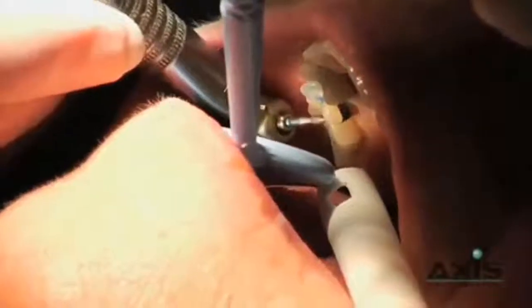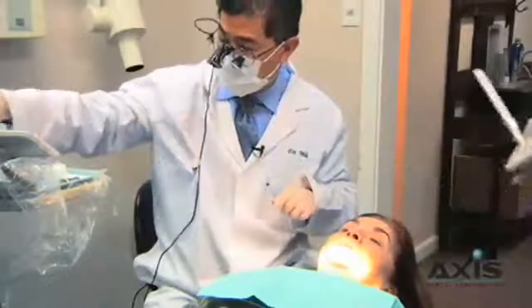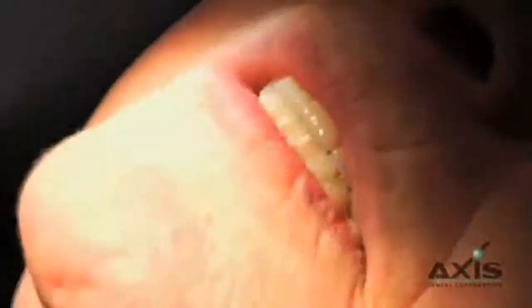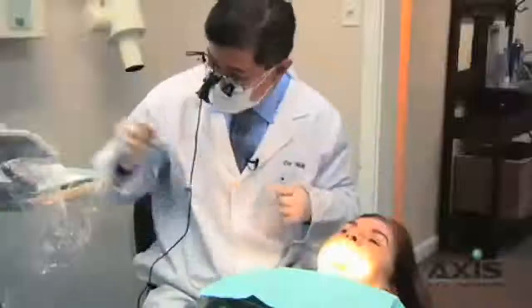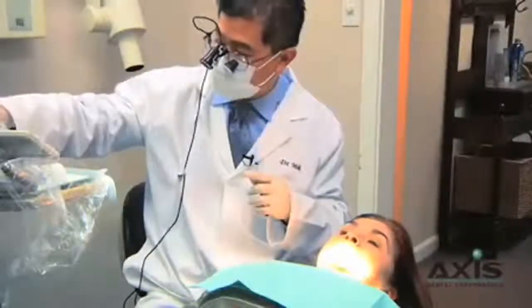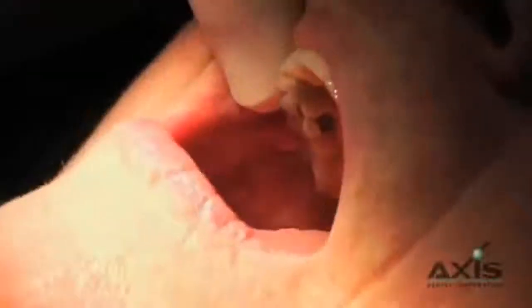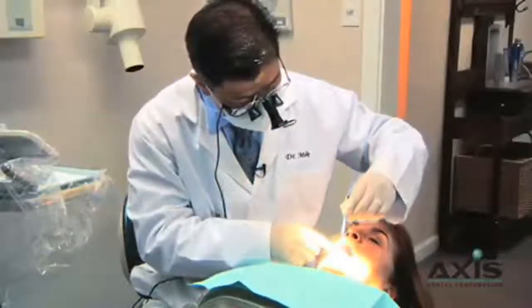We're going to get a little bit of water going there. How's that feeling? Still hitting hard? A little better. We want to make sure the teeth are dry when we adjust the bite, especially after this restoration has been glazed, because we can miss spots. It's nice and smooth.